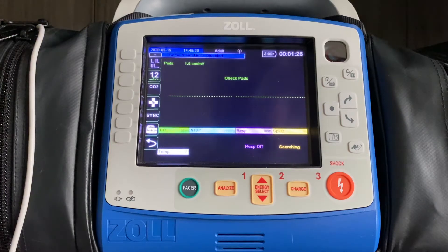Hi everybody, this is Kyle Sears from Zoll. Today's X-Series Tips and Tricks video is going to focus on maximizing the effectiveness of our finger probe.